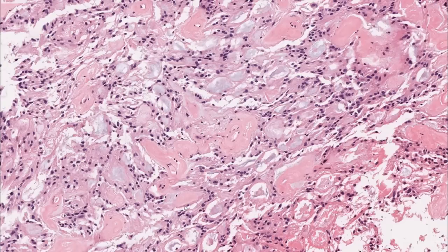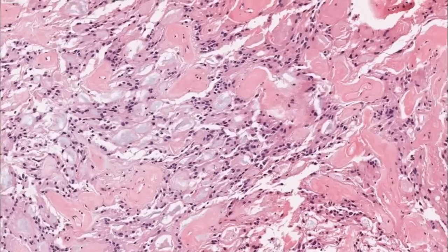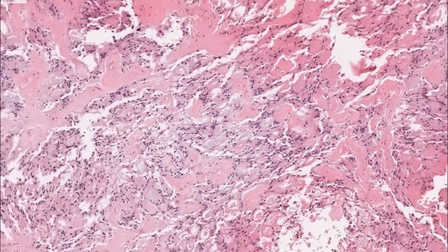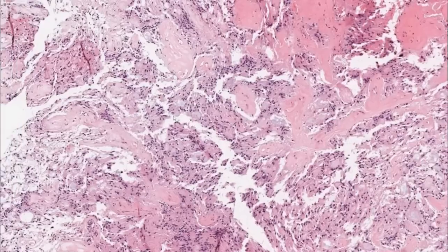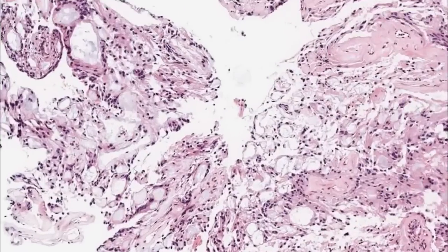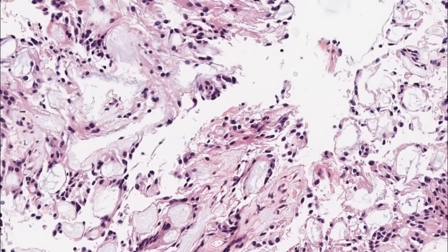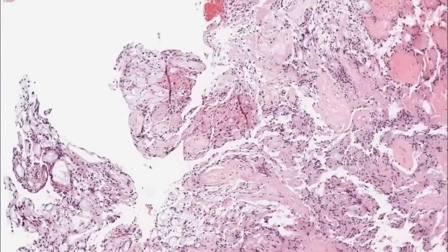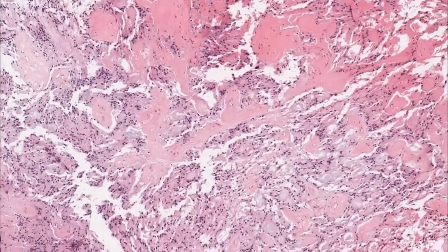The differential may be wide. The differential includes metastatic adenocarcinoma, particularly when you see a lot of these microcysts. They can simulate gland formation. Chordoma also, which tends to have a myxoid stroma as well. Those are the two major differential diagnoses. But again, this myxoid stroma almost always occurs at the distal spinal cord, with very few exceptions.